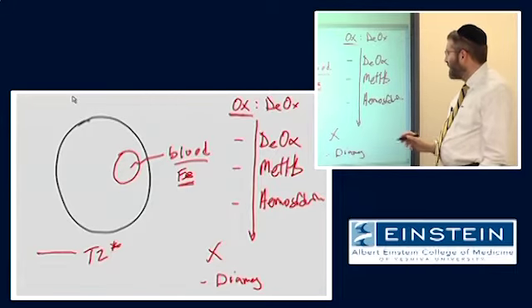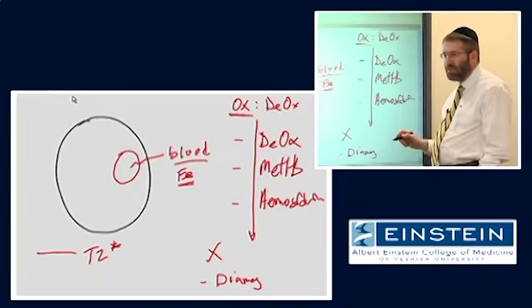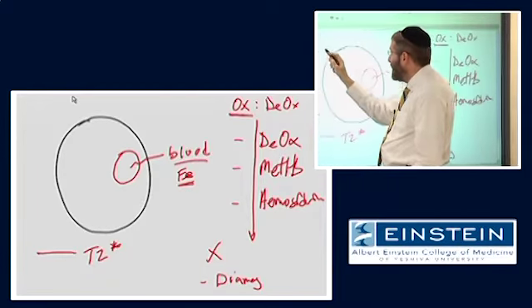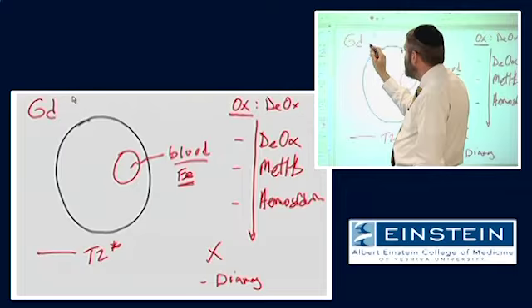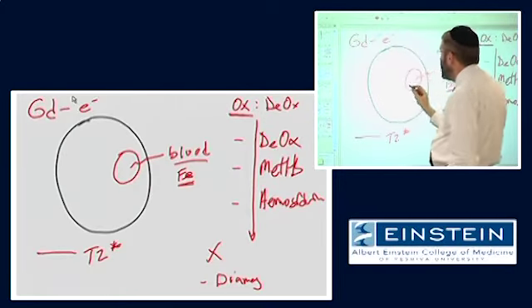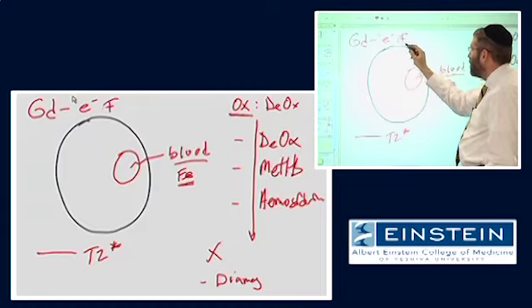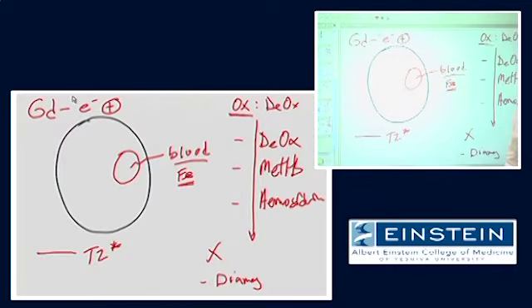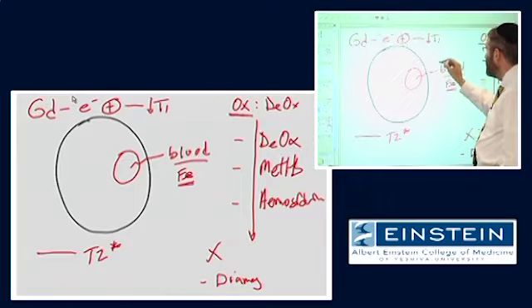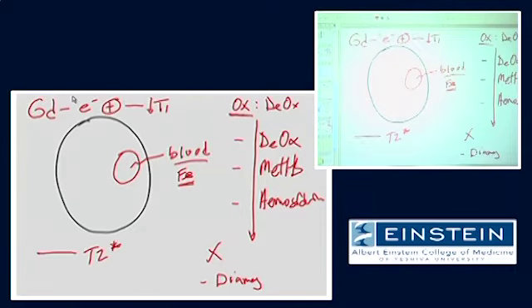And that is the fact that these paramagnetic substances, as we talked about when we talked about contrast agents, with gadolinium, for example, we said that the gadolinium electrons can interact with our water protons to dramatically accelerate spin lattice relaxation, to shorten the T1 of whatever it is that we're measuring.